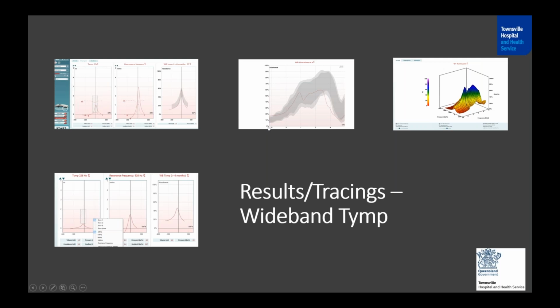Usually in most clinical studies, 1/3 octave is more than sufficient for clinical purposes, whereas 1/24th gives you a much finer resolution, so you get a lot more points for analysis. If you're looking at measuring the significance of difference, you get about 60 different points, which is hard to compare. Whereas when you measure at 1/3 octaves, you get about 16 points. So it's much easier to manage and compare the different points.